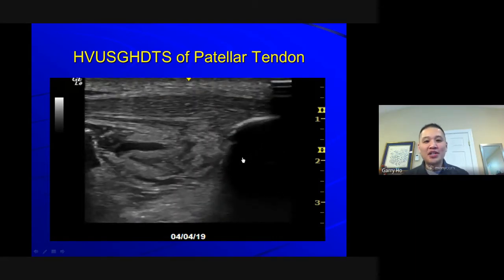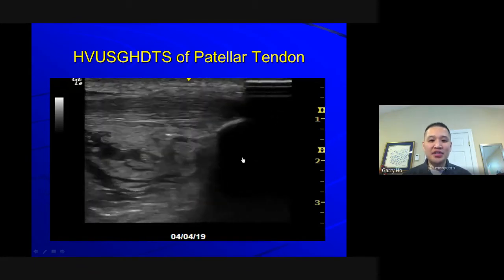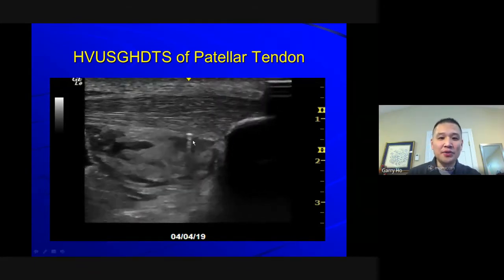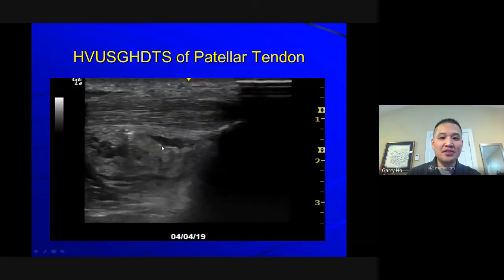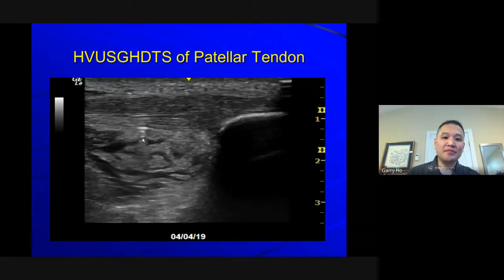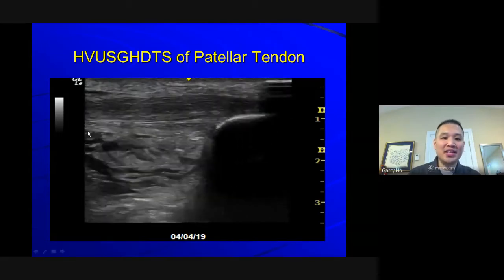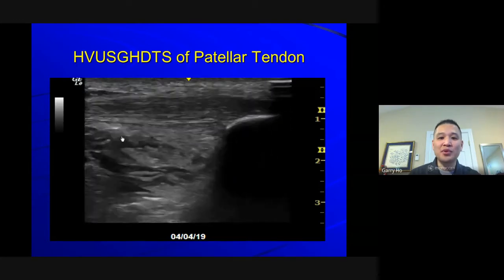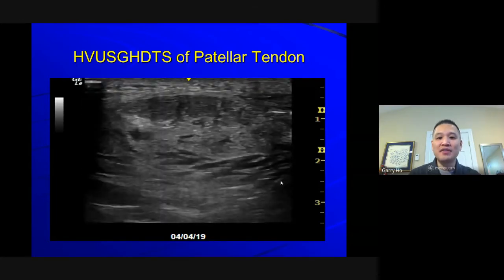And through a combination of all those techniques of injection and needle tip, you can see there using the bevel of the needle as a cutting tool and injecting together to split apart that cut that I created. I'm essentially debriding and separating that tissue plane between the Hoffa's fat pad. And my goal is to get this freely mobile needle underneath, free of those adhesions.